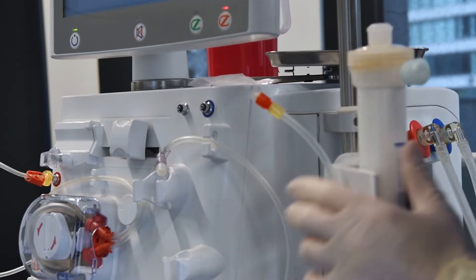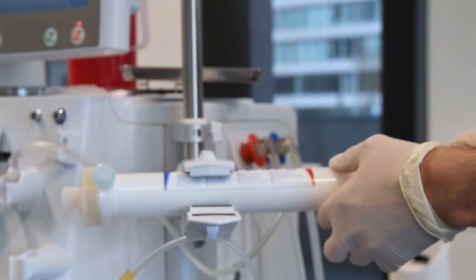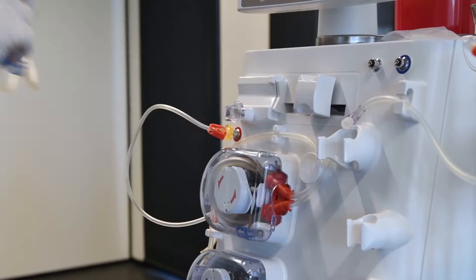Use the line holder for the bloodline leading to the dialyzer and attach the red connector to the dialyzer. Place the arterial line in one of the line holders for now.